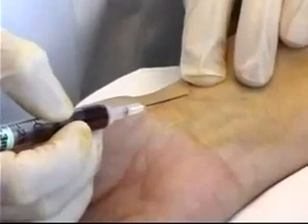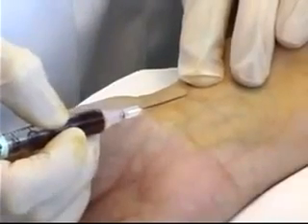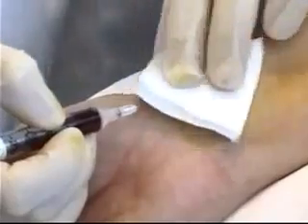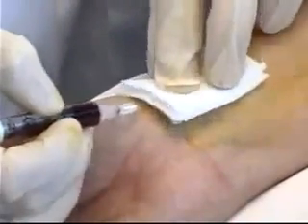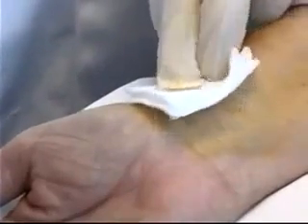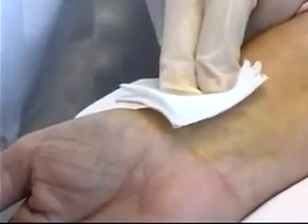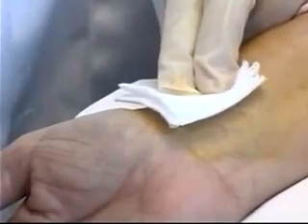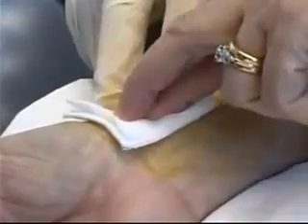Once I've obtained an adequate blood sample of one and a half to two cc's, I'm going to cover the area with my 2x2 gauze and very quickly pull the needle out of the skin. I can apply pressure myself to the area for approximately five minutes, unless the patient is on anticoagulant therapy, in which case I should double that to ten minutes. If my patient is cooperative, I can ask her to please apply some pressure over that area until I come back and tell her otherwise.